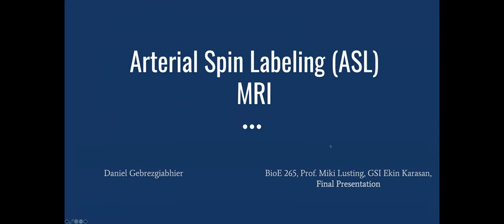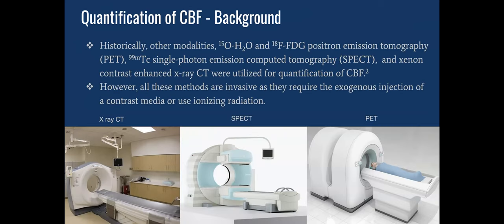Hi, everybody. My name is Daniel, and I'll be talking about arterial spin labeling, which is a quantification of cerebral blood flow. A little bit of the background.